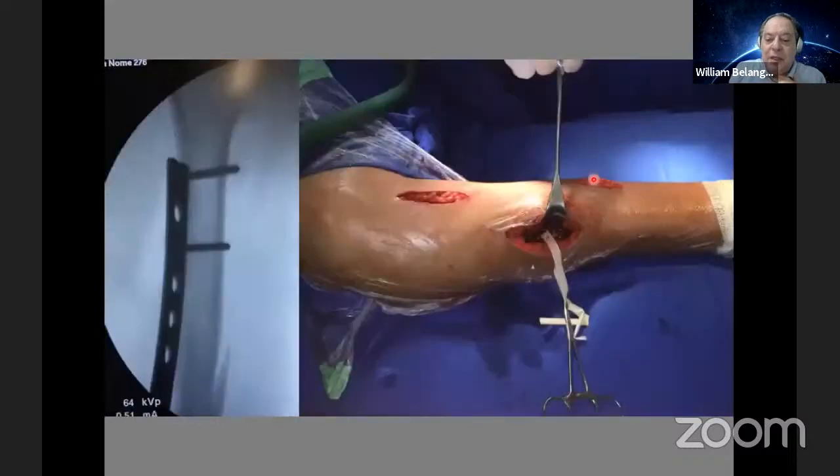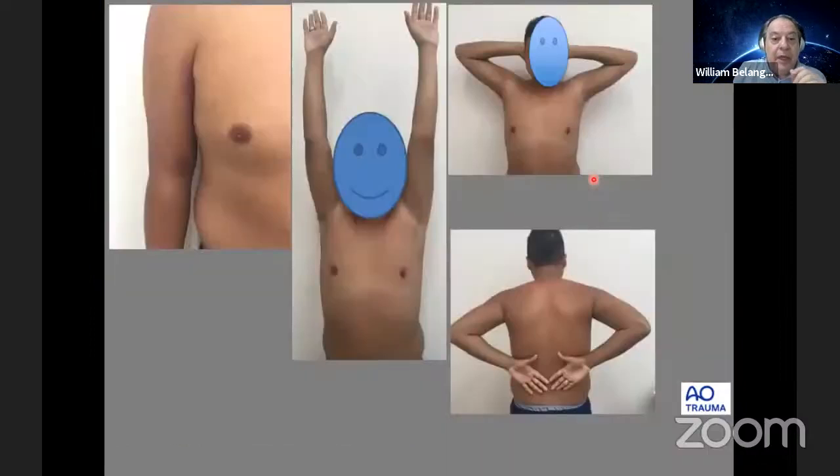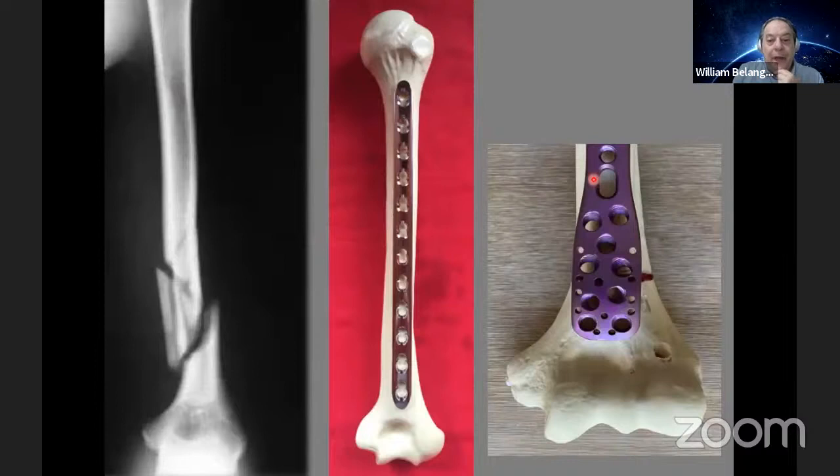It is not a problem to use the screws side by side. And in this case, the patient had a secondary radial nerve palsy. We explored the radial nerve using another approach between brachialis and brachioradialis, and treated the radial nerve and the fracture. Okay, this is the evolution, very good bone healing, and this is the clinical evolution.